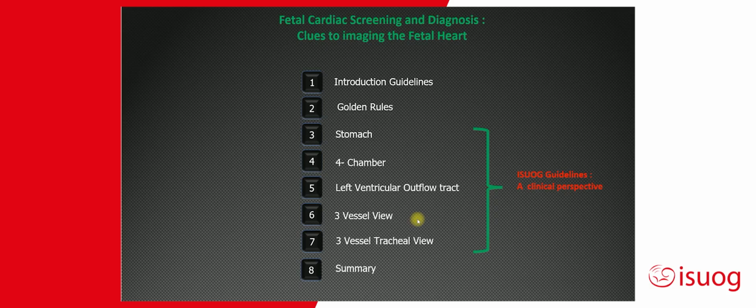So it's quite a compact, fact-packed lecture. You may need to go back and slow it down and listen to it, but I will cover a lot of ground going through all these sections and all the sentinel, about 45 cardiac anomalies. And then I'll finish up with some summary, some comments, and some take-home messages.